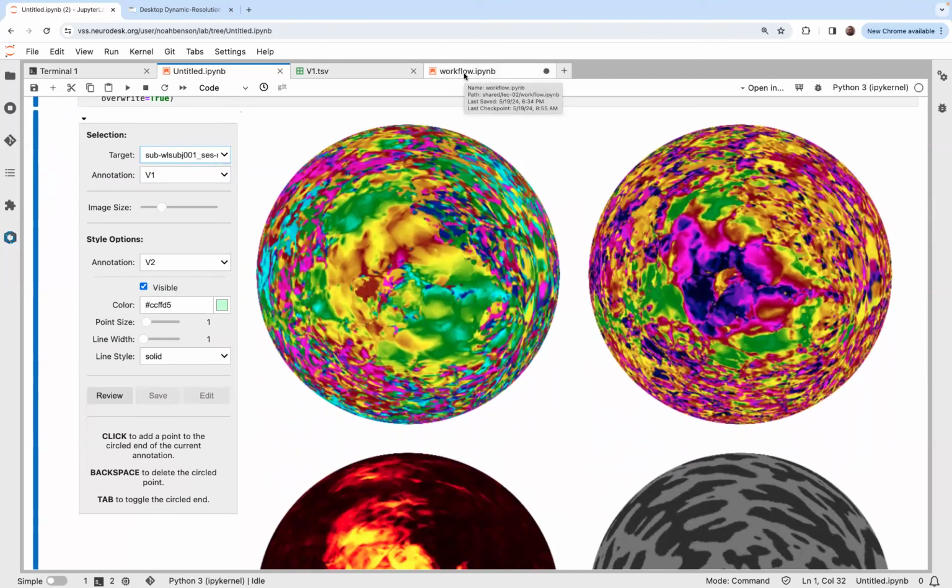So you could use a different configuration file to load other localizers? Absolutely, yeah. It was specifically made so that localizers and other kinds of things aside from retinotopic maps would work. In fact, there's no reason why you couldn't use this to annotate images of anything you wanted. It doesn't have to be retinotopic maps. It's really just a tool for this kind of interface. But it comes with a bunch of neuroscience examples.